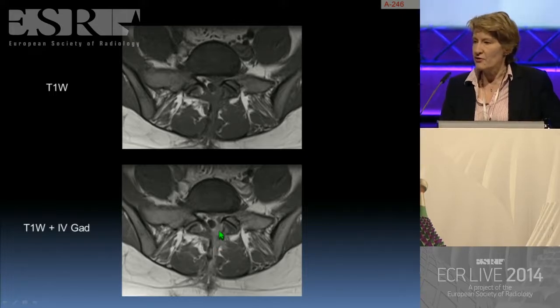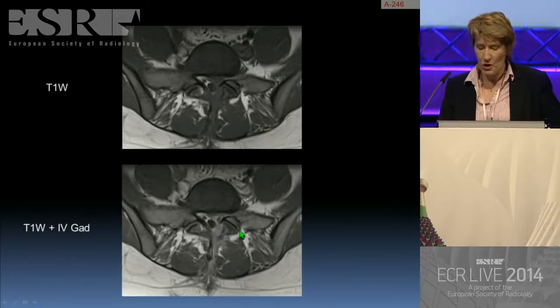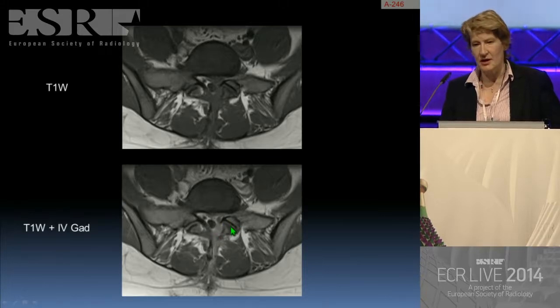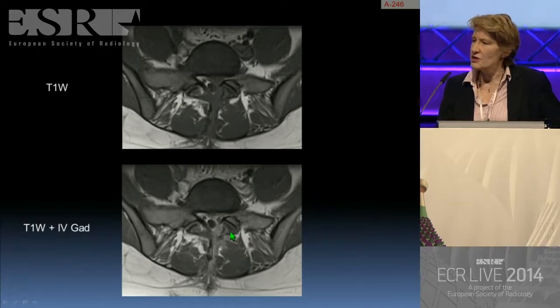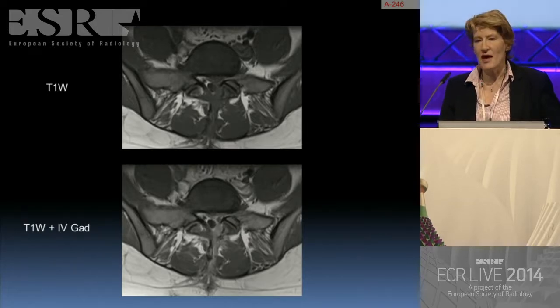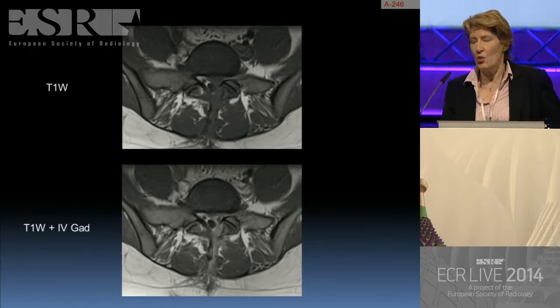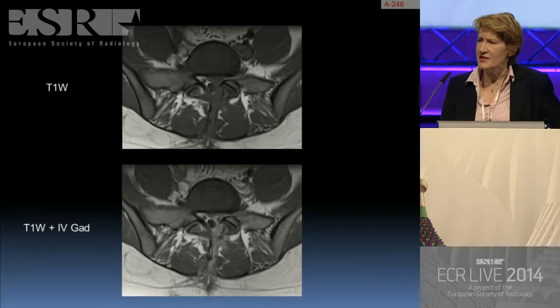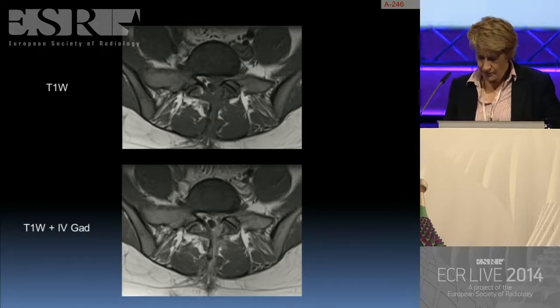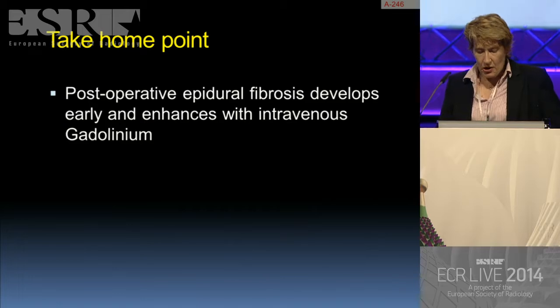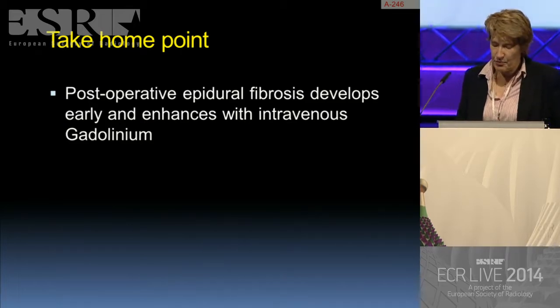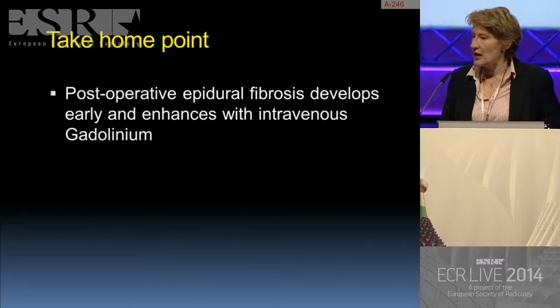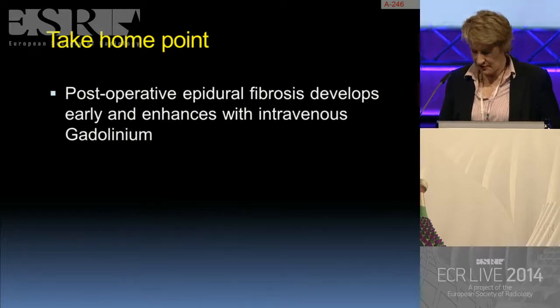This helps confirm the diagnosis of epidural fibrosis. If this was a recurrent disc herniation, one would not expect to get this degree of enhancement. With infective discitis, one expects to lose the definition of the end plates, which has not occurred in this case. The take-home point from this case is that post-operative epidural fibrosis develops early and enhances with intravenous gadolinium.